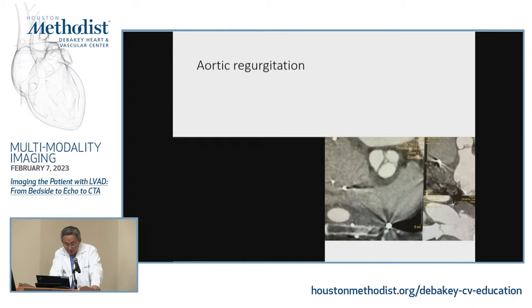And aortic regurgitation, I think that Dr. Mahwash is really interested in this, and we can assess the anatomical area and study aortic regurgitation, or lack of coaptation, I should say. And we should probably study this more systematically.